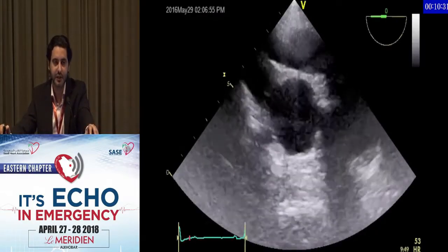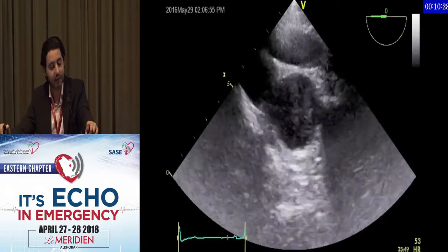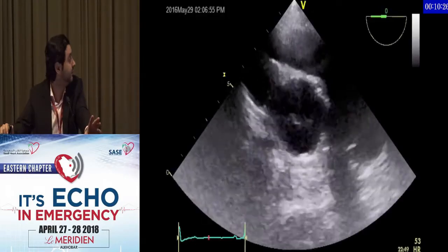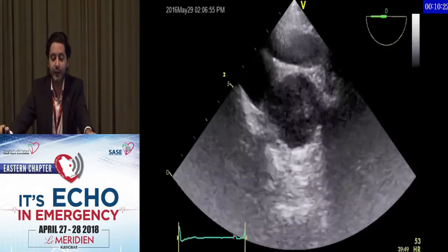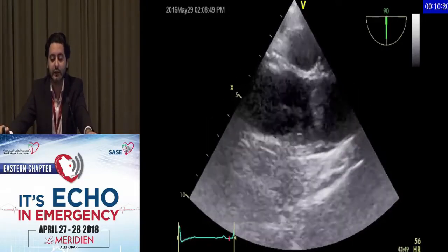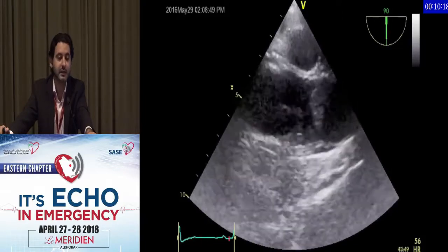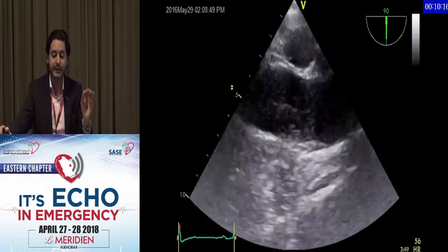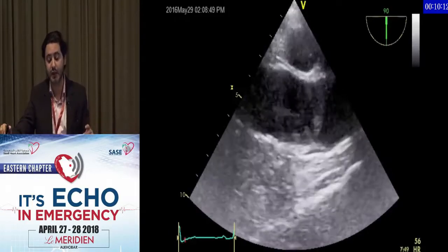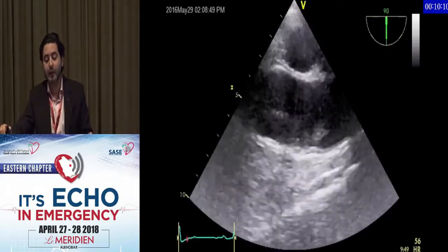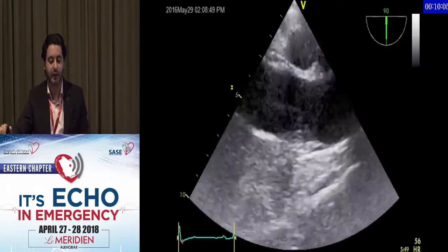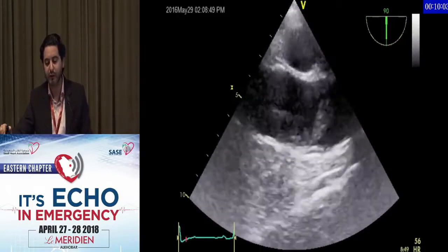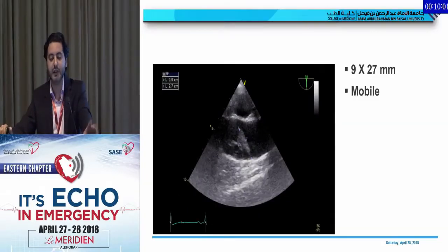Here is another patient's ascending aorta during TEE study. You can see something — a thrombus coming into view, highly mobile. This is a dangerous thrombus; it can embolize very easily, attached to a complex atheroma. The atheroma is irregular, large, looks more than four millimeters, so it has to be removed. The thrombus measures nine by 27 millimeters.